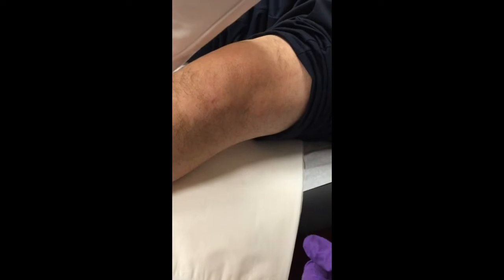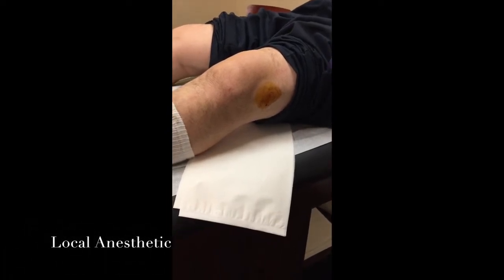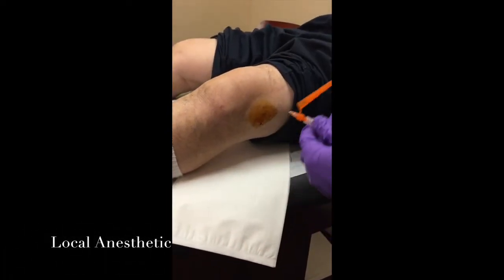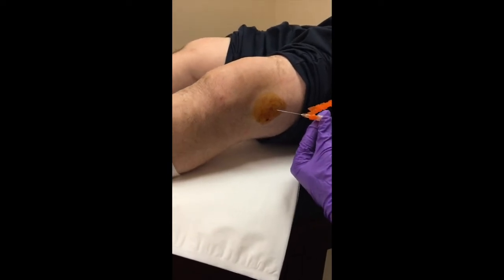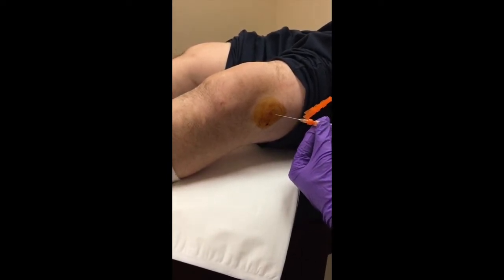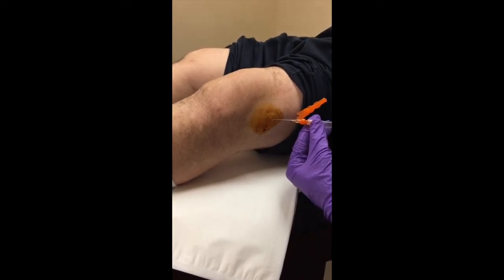Now that we have him prepped and wiped down with alcohol and betadine, we take our local anesthetic and create a small wheal right underneath the skin. You're going to feel a pinch on three — one, two, three — a small pinch, then a little burn sensation as we create the wheal.